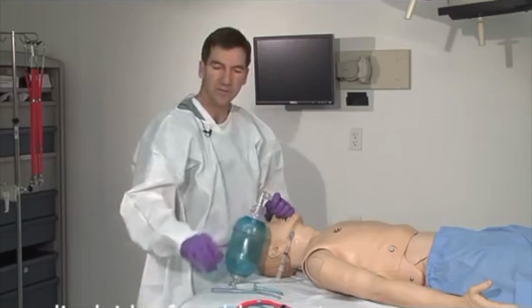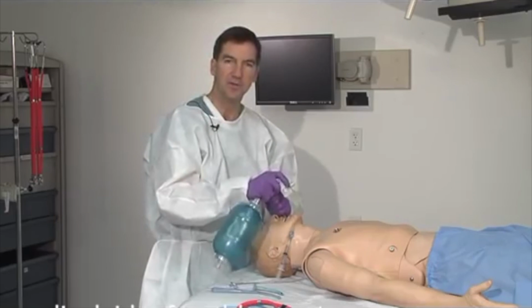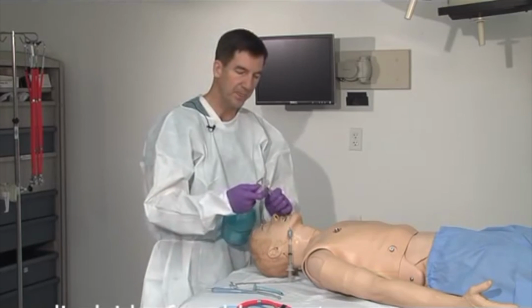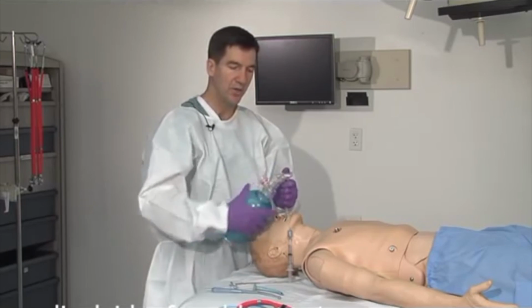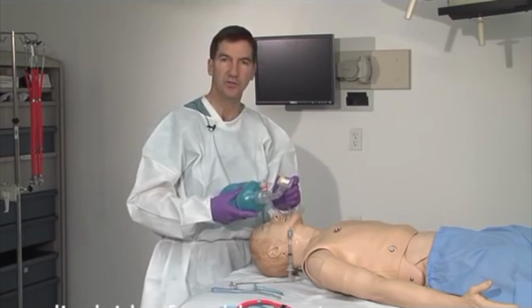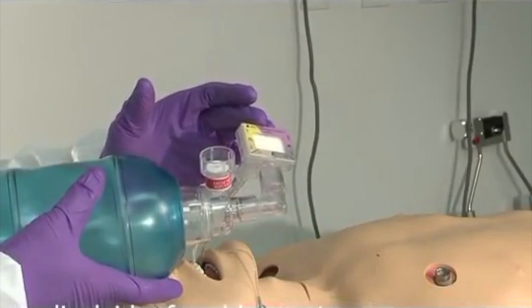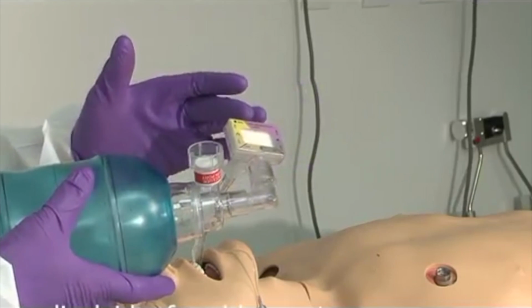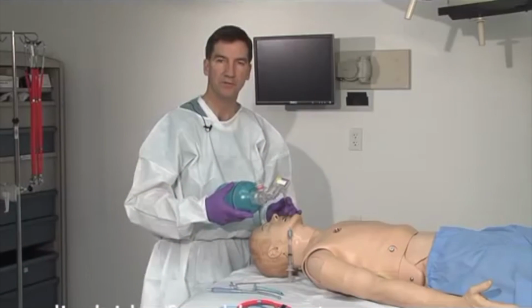An additional device is the end-tidal CO2 monitor. Once the patient has been intubated successfully, this device allows you to double check and make sure that you're in the trachea. By placing this device between the endotracheal tube and your bag, you're able to watch for a color change that occurs that witnesses the CO2 level rising with your resuscitation. Normally the color is purple when it comes out of the bag, showing low CO2 concentrations, and you expect to see this change from purple to tan to yellow, letting you know that you have successful intubation.